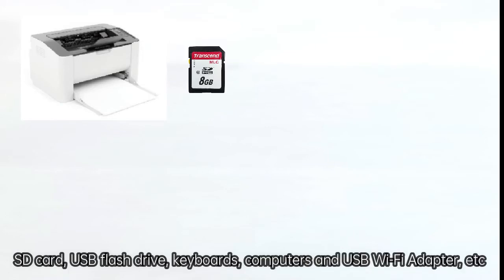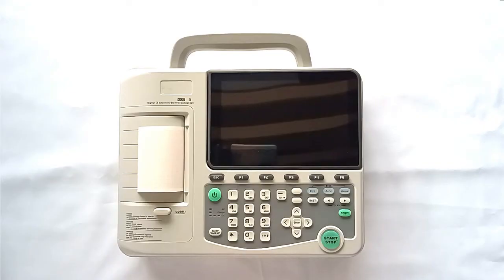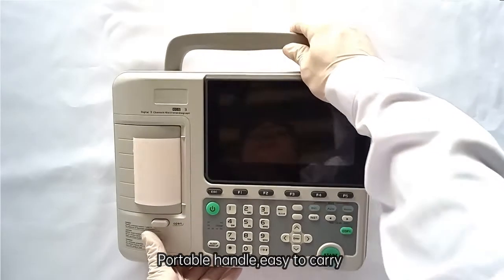The ECG can be connected to specified models of USB printers, SD cards, USB flash drives, keyboards, computers, and a USB Wi-Fi adapter. The device also features a portable handle for easy carrying.